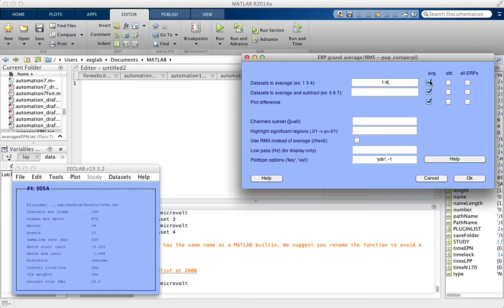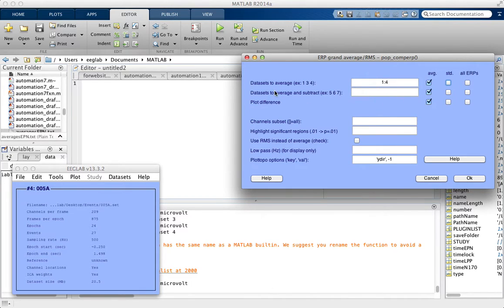This checkbox means it's going to plot the average, which we want. If you also want to plot the standard deviation, you can check that. And if you want to plot all of the ERPs in these datasets, you would check this box.